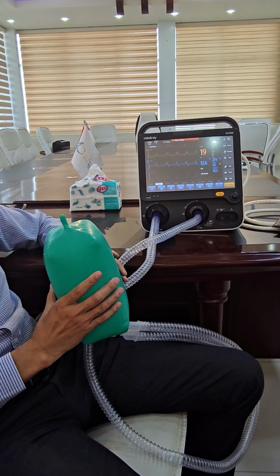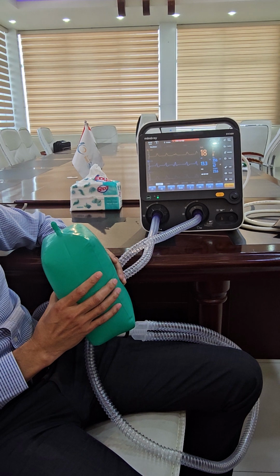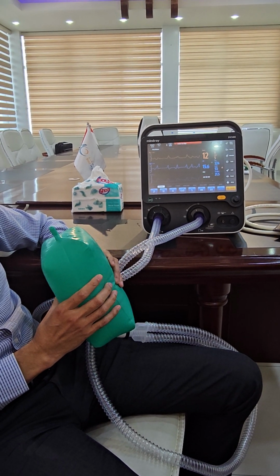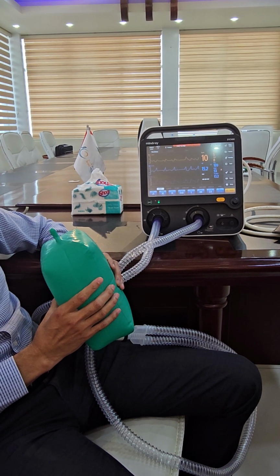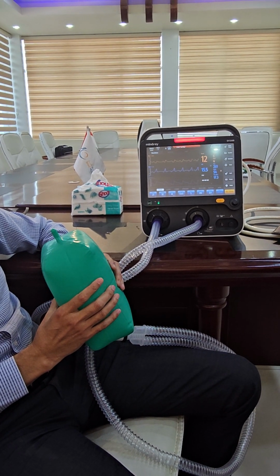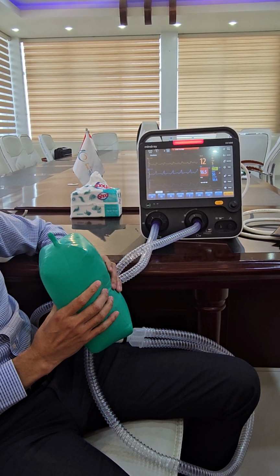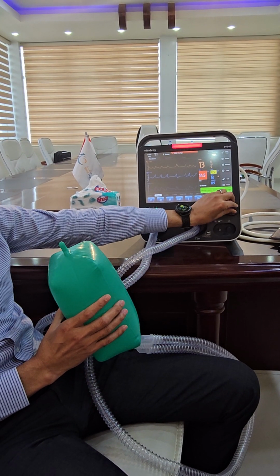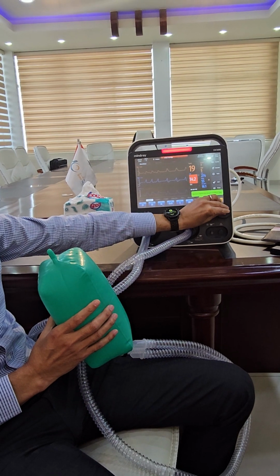How do you know it's assisted? Look at it when I decrease the trigger. I don't want to confuse. Let's make the figure 1.